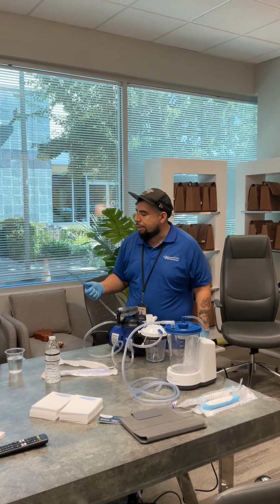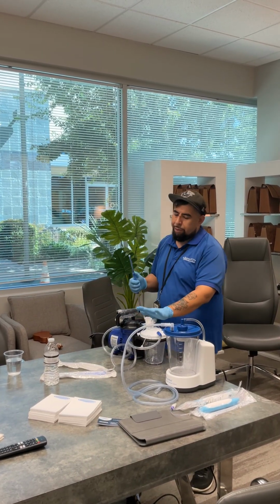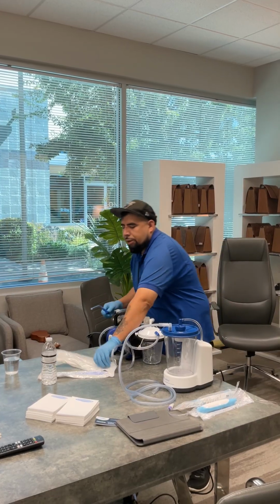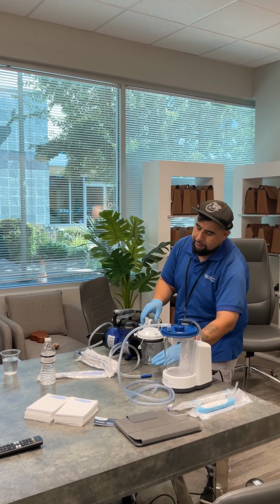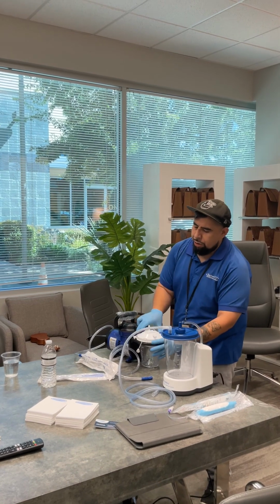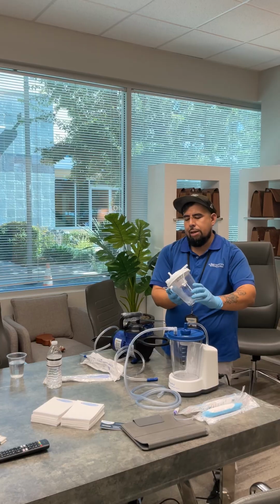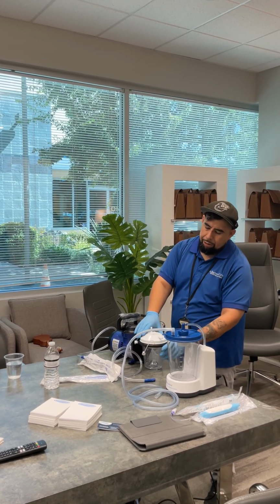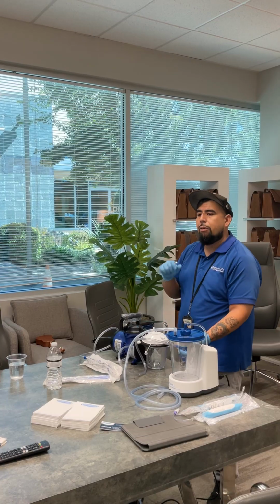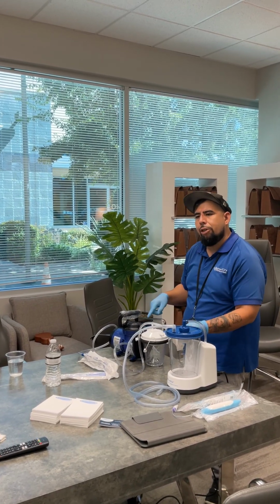But with that being said, once we remove some type of liquid, food material, or foreign material, we are going to remove this 3/16 tube. This suction tube, we will take out the collection canister. We can empty that out anywhere you feel necessary. And I recommend usually for the family to microwave a cup of water and suck up the hot water to clear out the tubing.